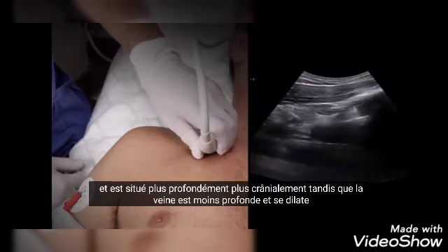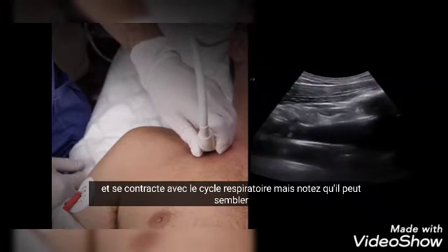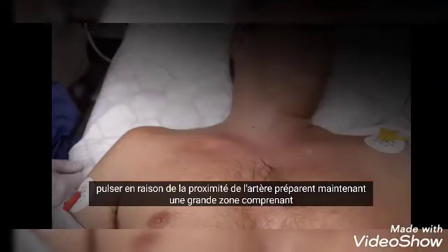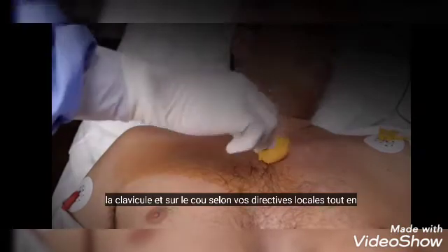The artery usually pulsates and is located deeper and more cranially, while the vein is shallower and expands and contracts with the respiratory cycle. Note that the vein may appear to pulsate due to the proximity to the artery.